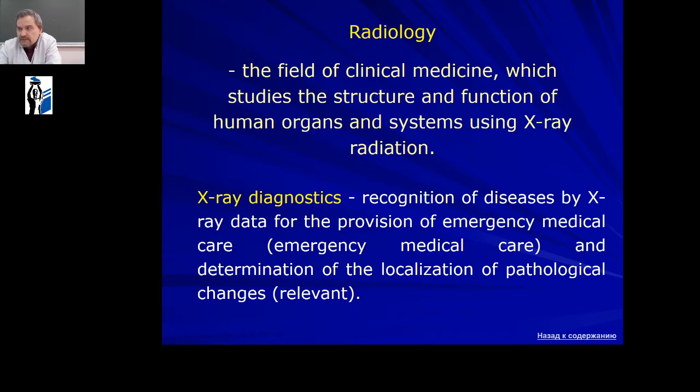And X-ray diagnostics, recognition of diseases by X-ray data for the provision of emergency medical care, and determination of the localization of pathological changes relevant.